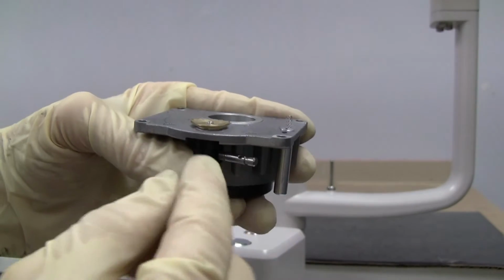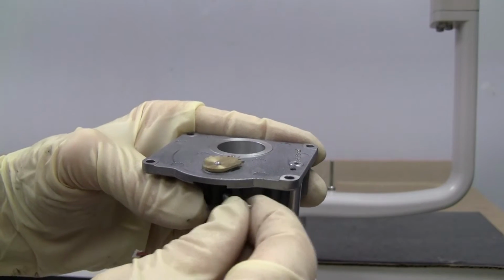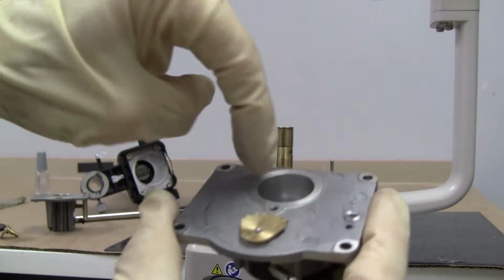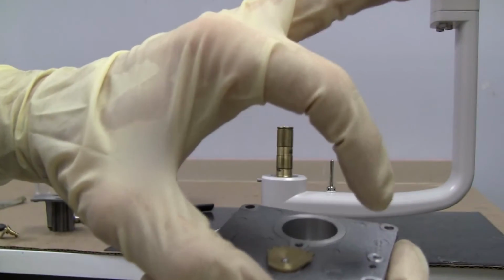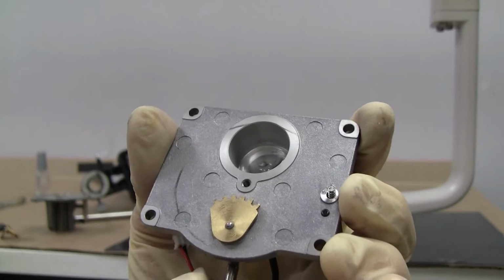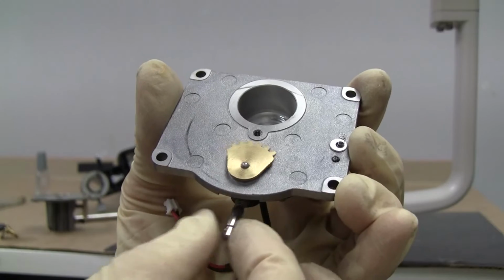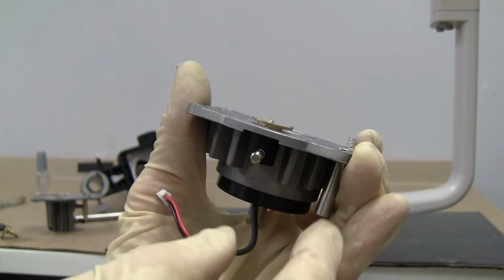So we're going to loosen this and put it somewhat in the middle and hand tighten for now and put everything back together. We've got to put our filter wheel in here. So now we've got the lever more in the center of the gear, and now we can work with it. Now we can adjust our detent for the filter wheel according to the cover.